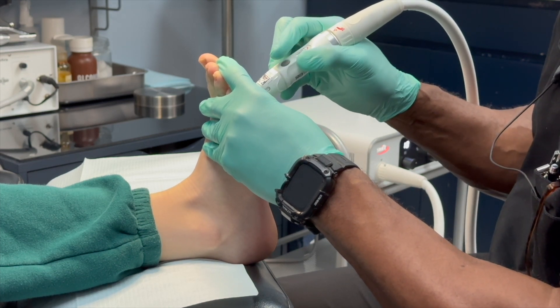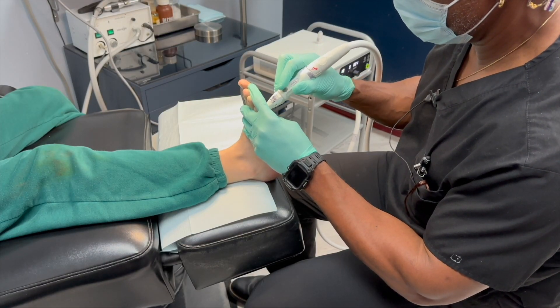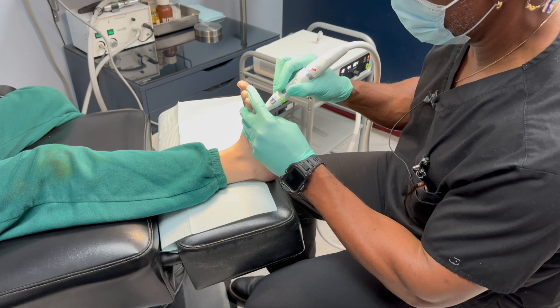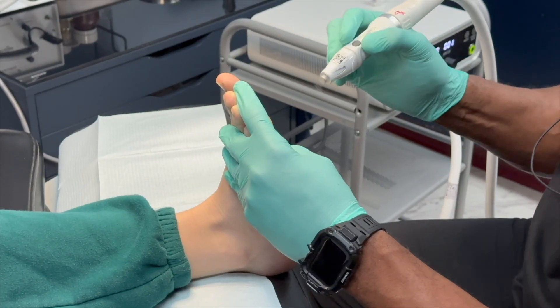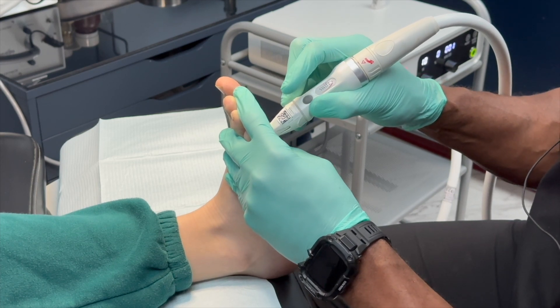Only the major warts have to be treated, and the sessions are brief, with the treatment of each wart consisting of 5 to 10 applications lasting 1 to 2 seconds each. There's no tissue damage, and most patients need only 2 to 4 sessions, spaced about a month apart.